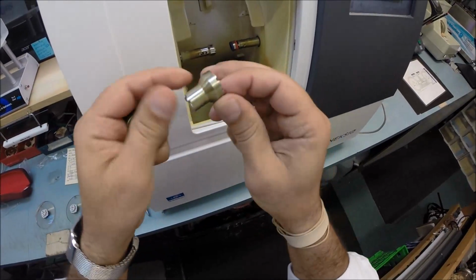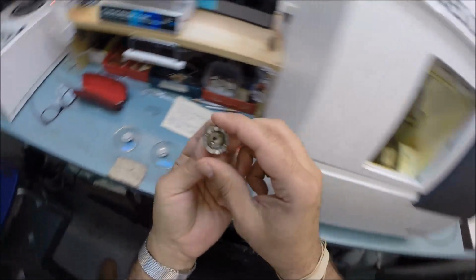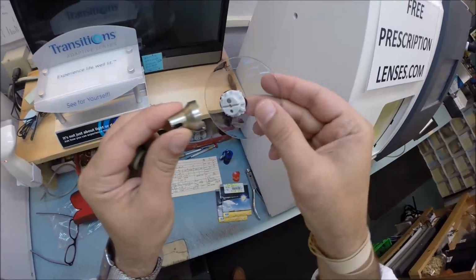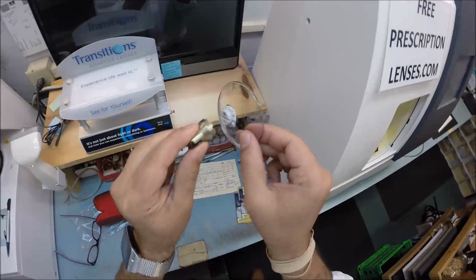This is the Chuck, or as you know, I like to call it the Charles, because I don't know Michelle well enough to call it that. So, there's that other magnet inside that holds it in place while it is there.